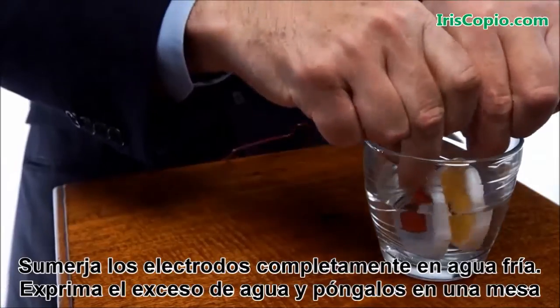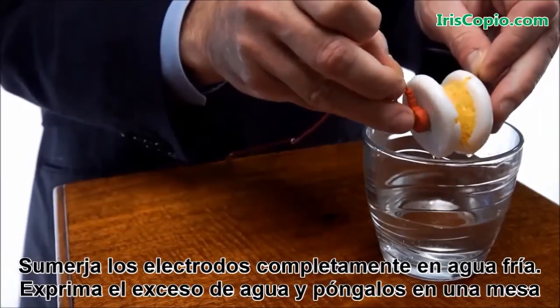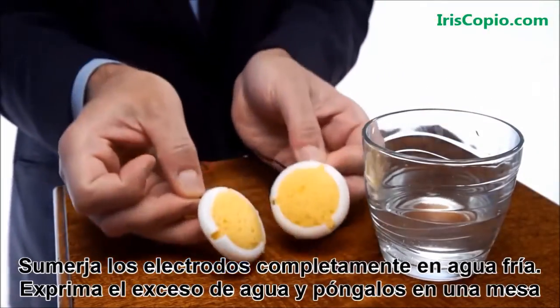The two yellow disks inside the headset caps are sponges that will expand when wet. Take the sponge applicators and dip them thoroughly into a glass of cold water. Squeeze out the excess water and place them on the table.